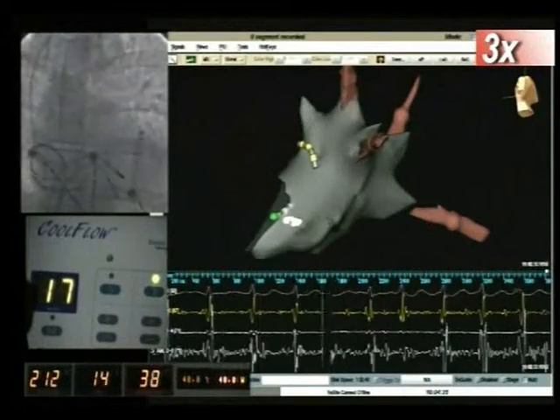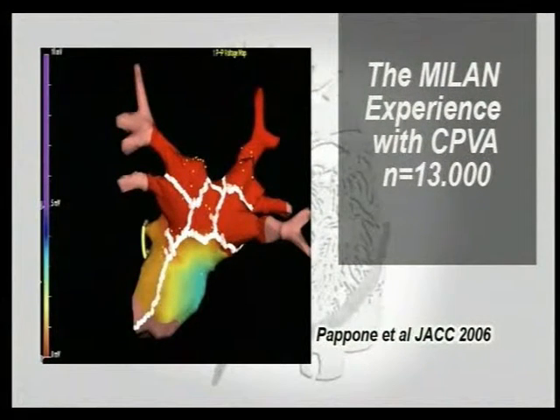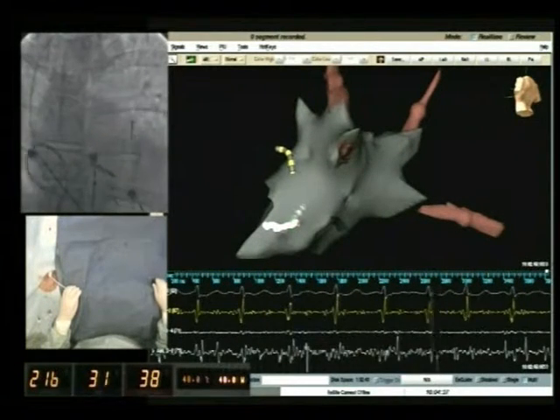The circumferential PV ablation or CPVA consists of circumferential pulmonary vein lesion lines performing a point-by-point tailored distal disconnection of all pulmonary veins, and additional lines including the mitral isthmus line, posterior lines, and cavotricuspid isthmus are also performed. The circumferential ablation lines can be either guided by 3D electroanatomic mapping, by fluoroscopy, or by intracardiac echocardiography.